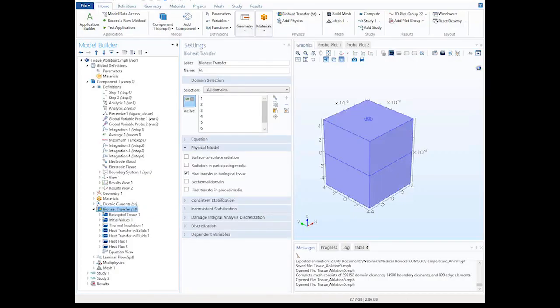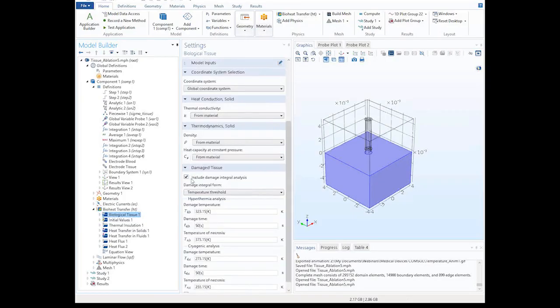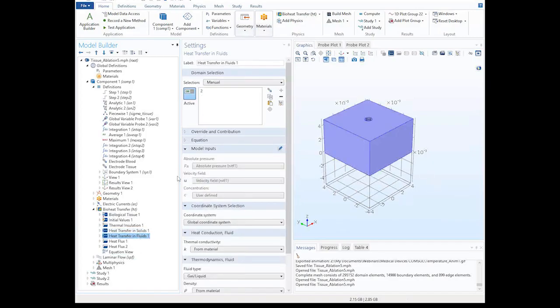What you see highlighted in blue here is the tissue model, and there is an option to activate these damage quantities and put your limits for when damage happens. For the solid, the electrode, there's no need for that damage, so just regular heat transfer in solids. And for the fluid, just regular heat transfer in fluid, and it gets the velocity field from the laminar flow, which I'll discuss next.